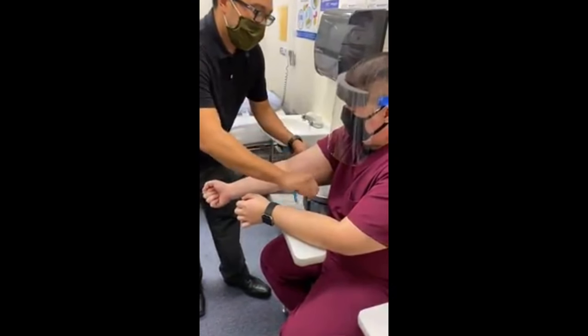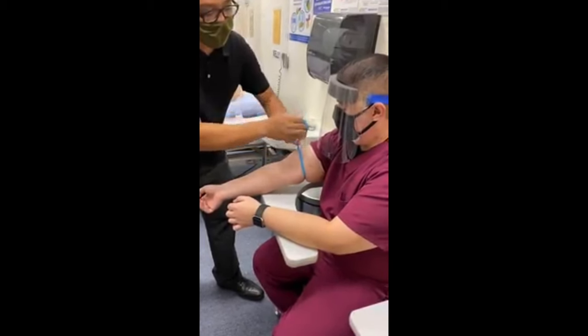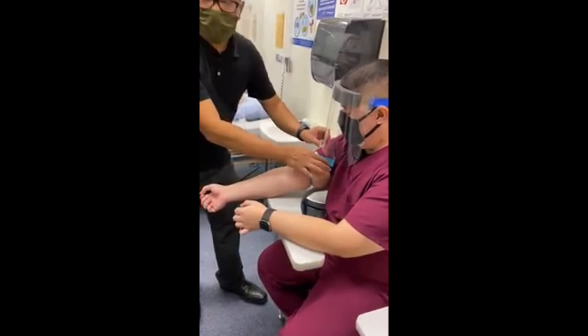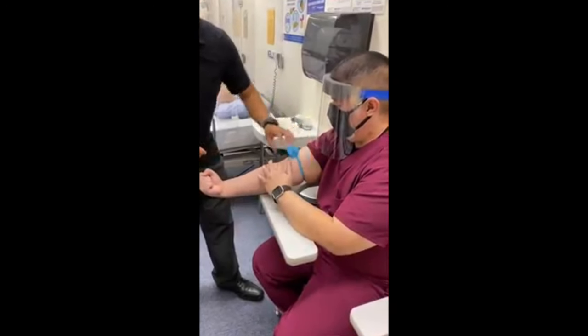So when I put it on, arm stretched, cross over, go under. You want the bunny ears facing upwards, away from the site, because you don't want this dangling here. Okay, so once it's there, that's a good tension on the tourniquet.